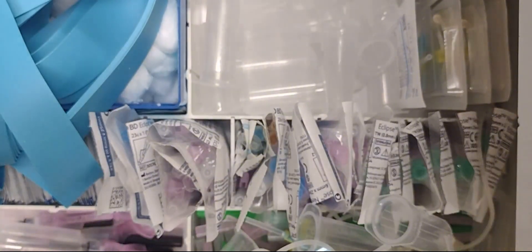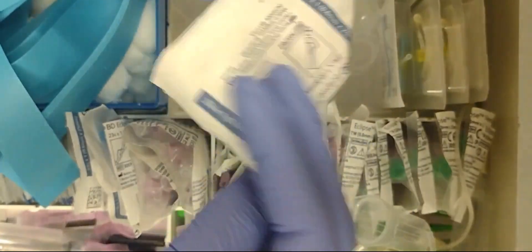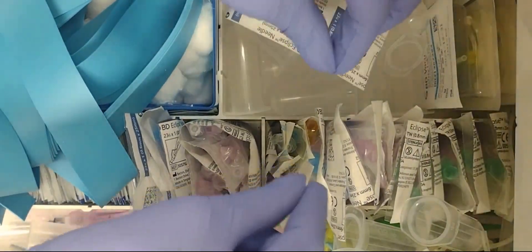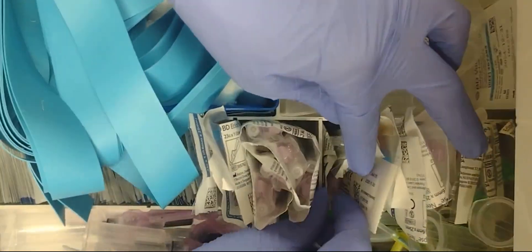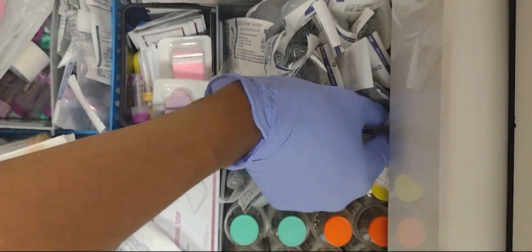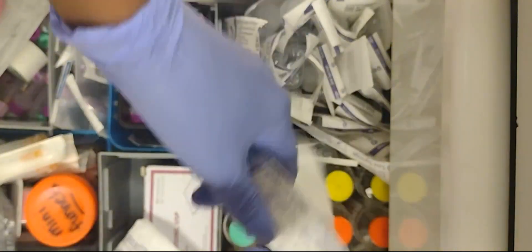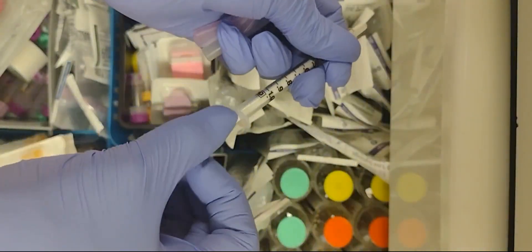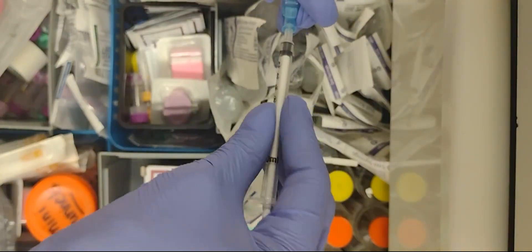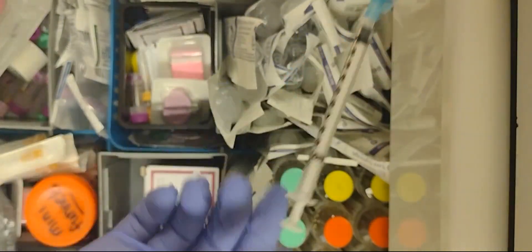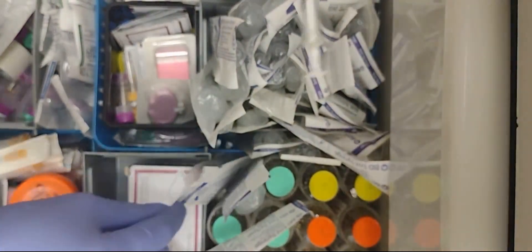So I do want to show y'all the eclipse needles we use when we're doing blood cultures. What we do with this—I got one that's open already for this video—we take this needle after we had already gathered the blood. I will demonstrate it with the one milliliter syringe. So I believe I've already gotten the blood from either a butterfly or most times it won't be a butterfly. So all you're doing is twisting it on the end.